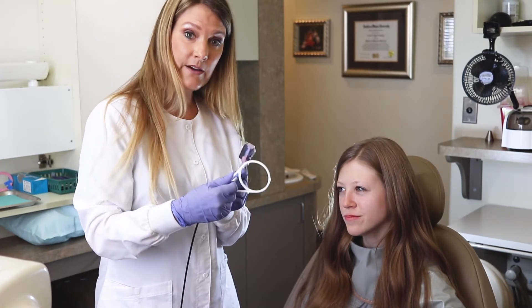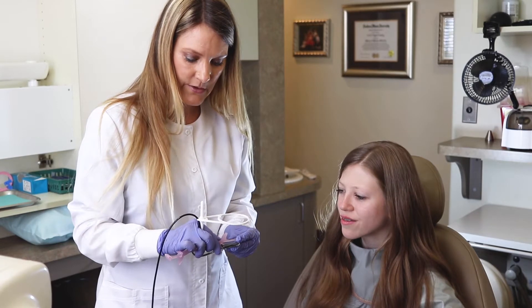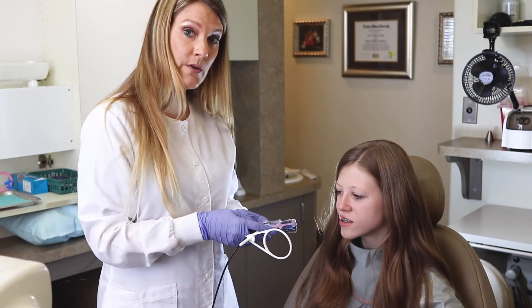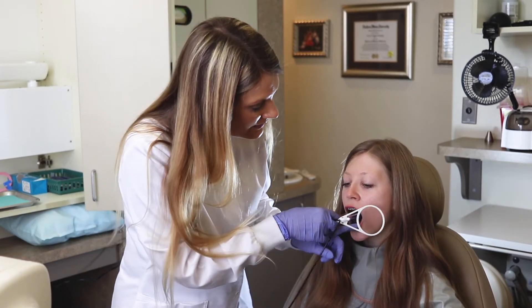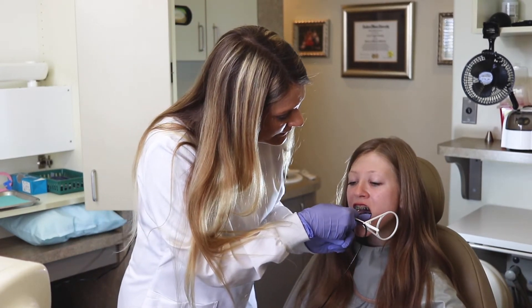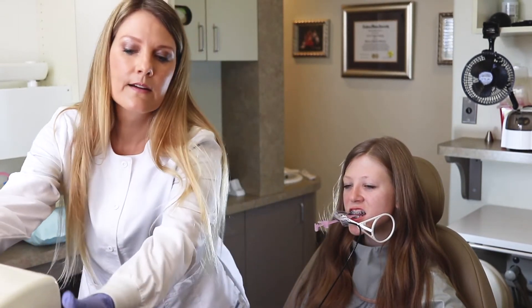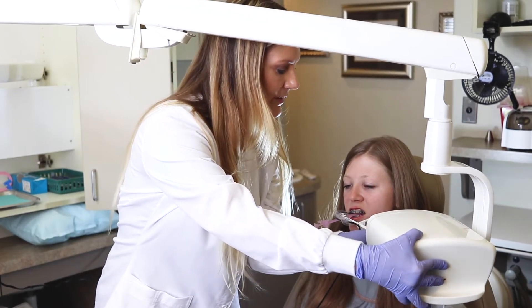We're going to click the ring down, and we are going to slide the Dentimax Dream Sensor all the way down. Now we're going to take two lowers and two uppers in the opposite direction. Your back posterior.